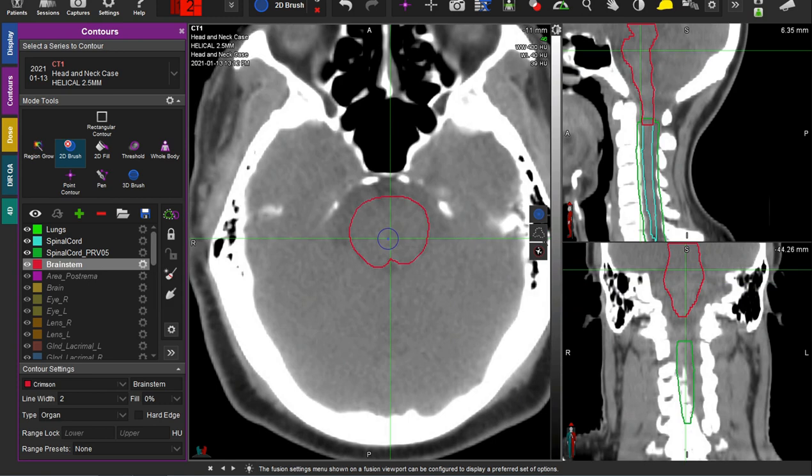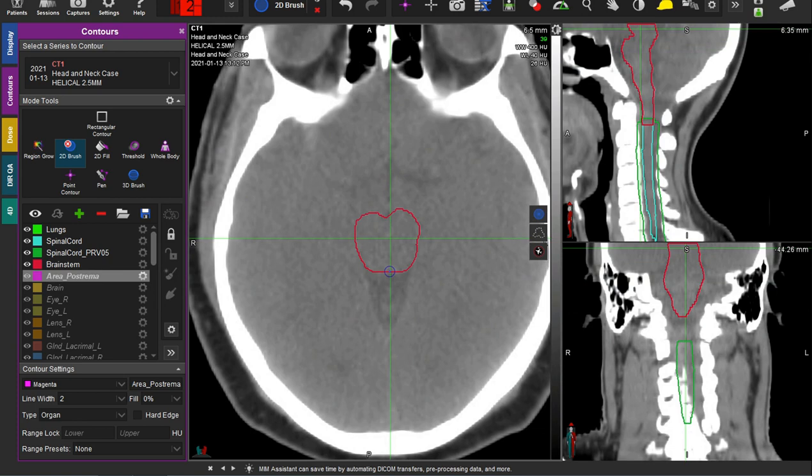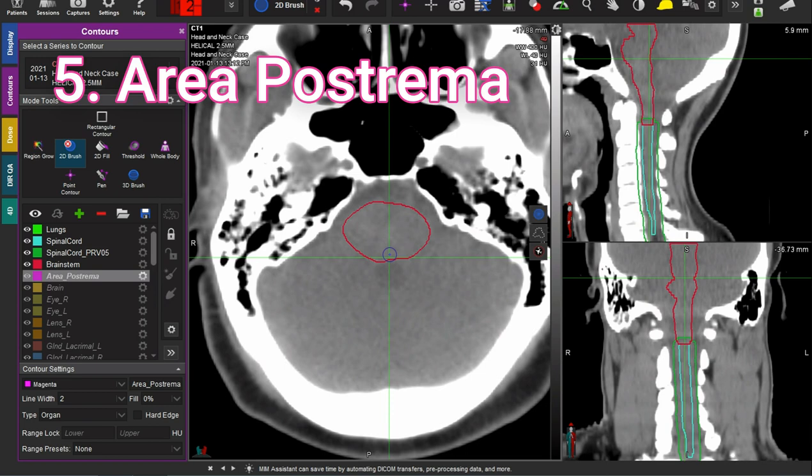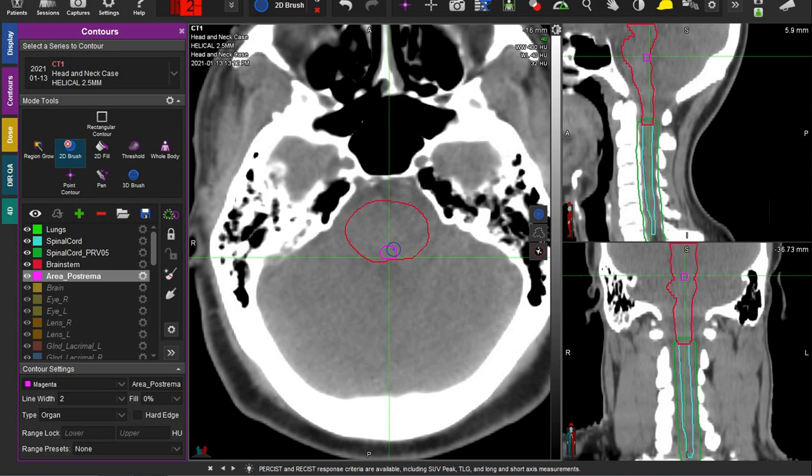Quick sanity check — scroll down to make sure everything looks okay. Now since I'm in the brain, this is optional, but we have the area postrema, which is right here, anterior to our fourth ventricle. This is a chemo center for our brain — a very sensitive chemo receptor. Avoiding it can help reduce the chance of experiencing nausea during treatment.